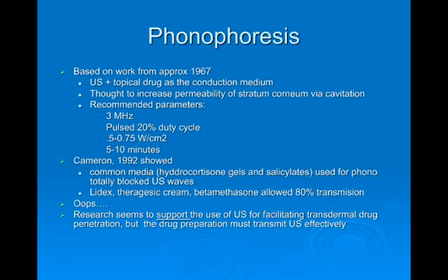But Cameron in 1992 showed that the common media that was used for mixing phonophoresis was totally blocking the ultrasound waves, which negated many studies that had been done in previous years. So rather interesting. So they had been doing this and showing some effects, but she looked at just what would transmit the ultrasound energy, and these totally blocked it. So rather interesting. Okay, so the things that will allow some transmission are listed there below.